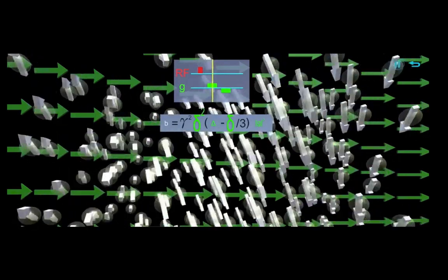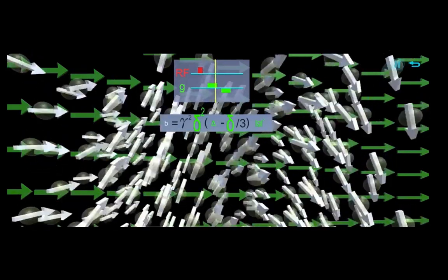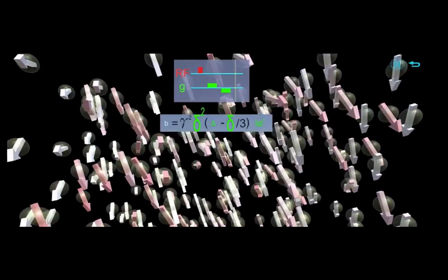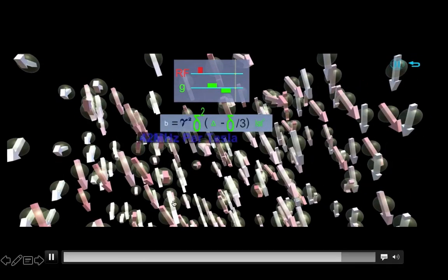And it's a very important principle of diffusion because, one, it's something that you do have some control over. And if you acquire your data at different B values, you get something called multi-shell acquisition. And that's an important property I'll talk about later. OK, any questions about this so far? That's the background that I'm going to be giving, and then most of the rest is talking about MRtrix.